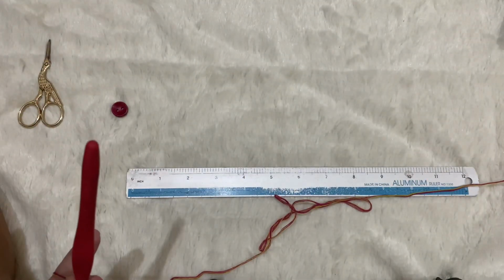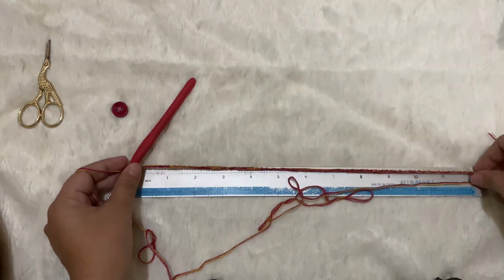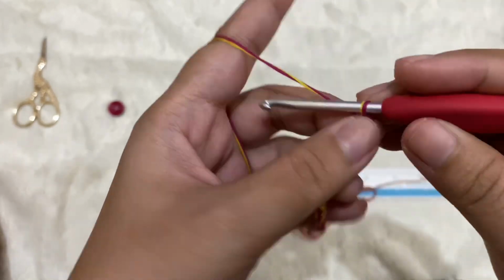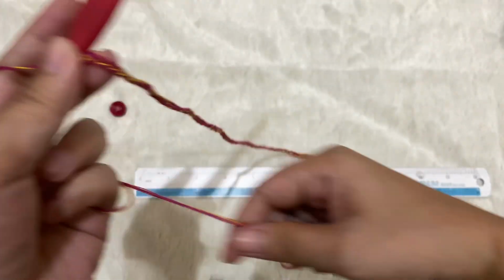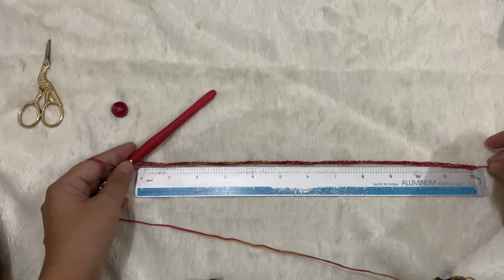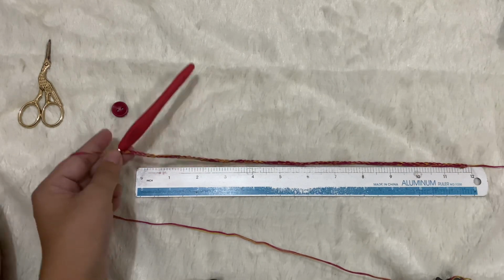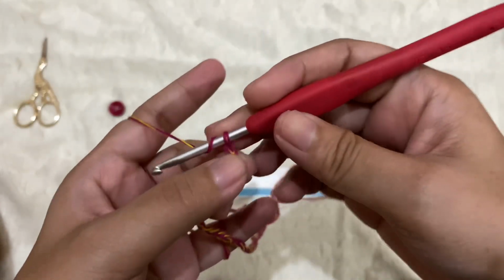Okay, and I'm using fingering weight yarn. This is fine cotton yarn and a 3mm crochet hook. So it's the length that we are after. That's why we don't have a specific number of chains, because if we're using different yarn weights or different crochet hook sizes, okay, we would need different number of stitches to reach that 1 foot length. And there we already have 1 foot chain foundation, and that's 70 chains for me.